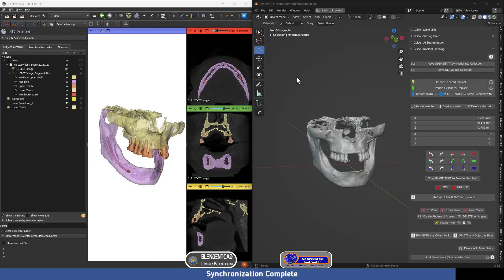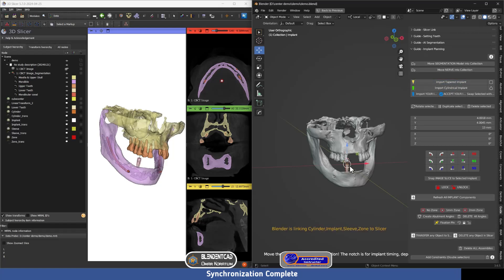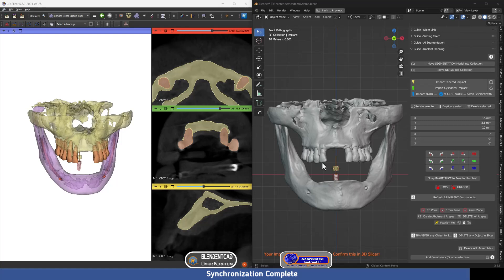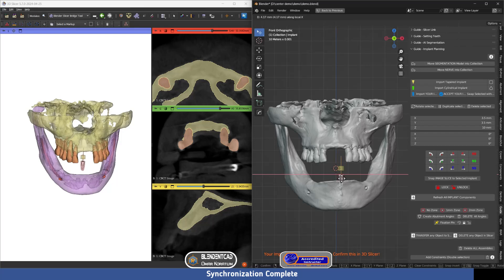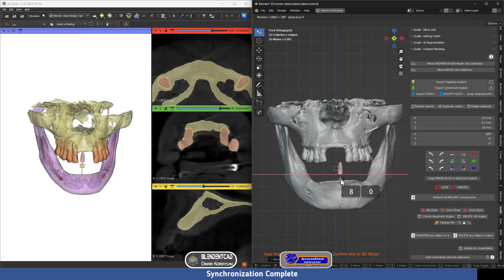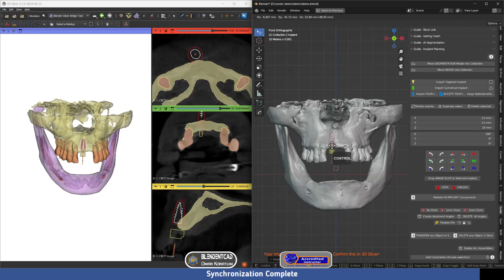To proceed with implant planning, go to the Implant Planning menu in Guide Designer and import a tapered implant. As you can see, the imported implant has been placed at the center of Blender for Dental and is also updated in 3D Slicer as well. To check that everything is working, I'm going to move the implant — as you can see it's synchronized with 3D Slicer. I'm going to rotate it 180 degrees and place it at the anterior area.